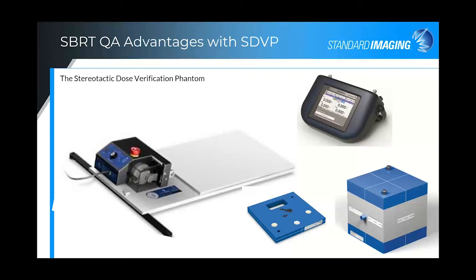The Exradin A26, W2 scintillator, and diodes are optimal, and specific inserts are designed for using these detectors in the SDVP. And these detectors are then used in conjunction with the SuperMAX electrometer. And this shows the lung equivalent density slabs, and the blue is the water equivalent, so gray is lung equivalent.